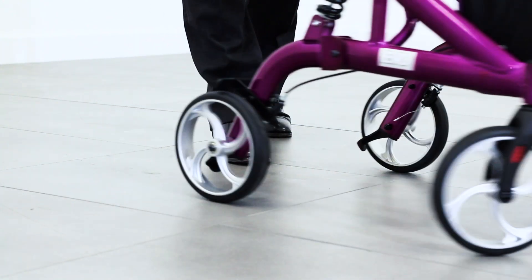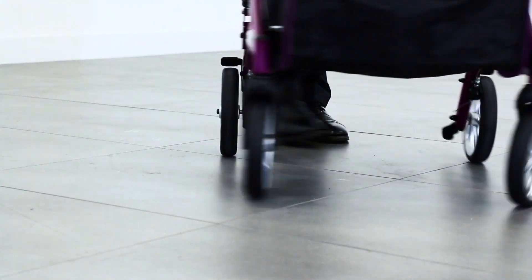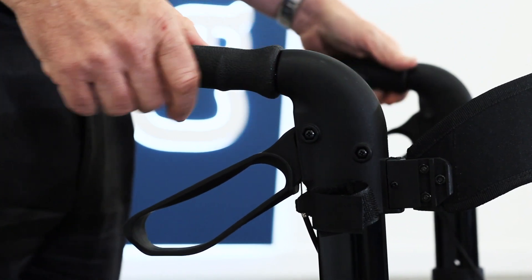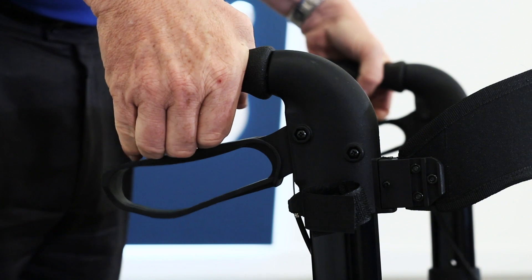Its four-wheel design, wider leg span, and swivel front wheels make for a highly maneuverable device. The height adjustable ergonomic handles are forgiving on the user's hands and wrists and come fitted with easy to activate locking cable brakes.